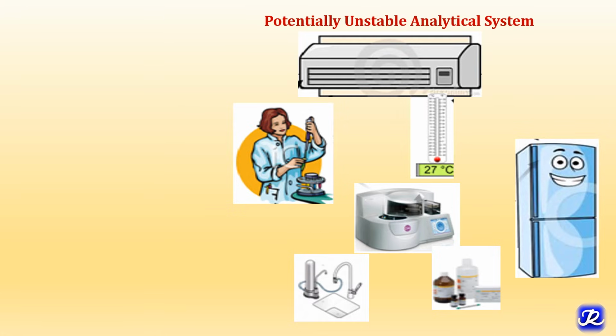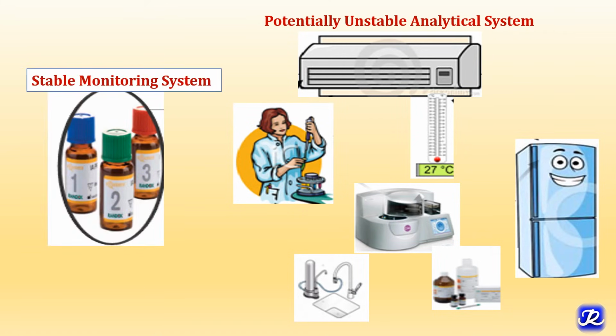Now, how do we identify that the system is unstable? It is done with the use of a stable monitoring system, and this stable monitoring system is a part of internal quality control, and it uses the quality control material, and this stable quality control material is used to identify the instability in the analytical system.